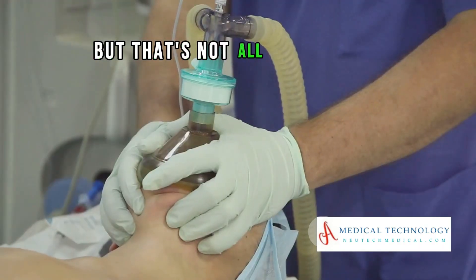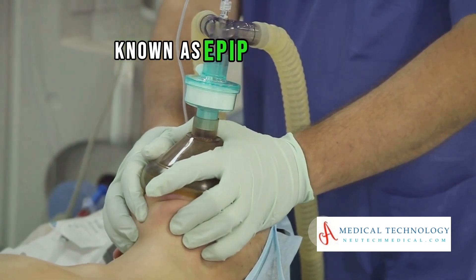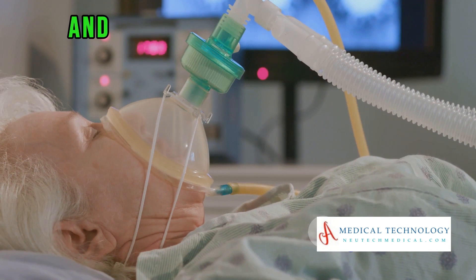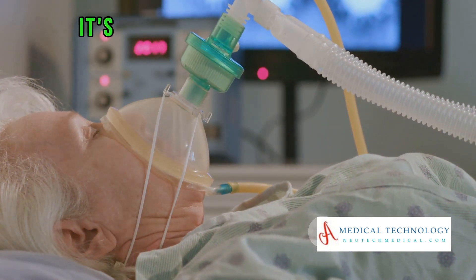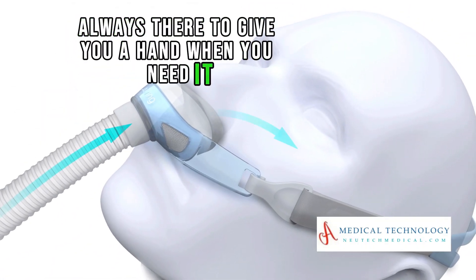But that's not all. When you exhale, the machine switches to a lower pressure, known as EPAP. This pressure prevents the airways from collapsing and maintains an open passage for the next breath. It's like having your personal breathing assistant, always there to give you a hand when you need it.